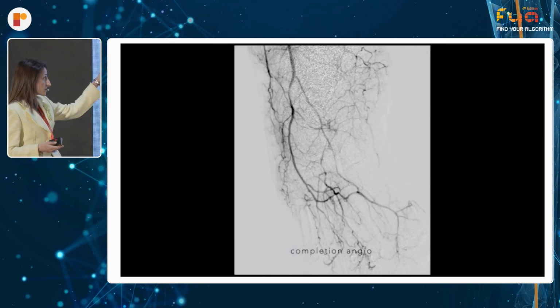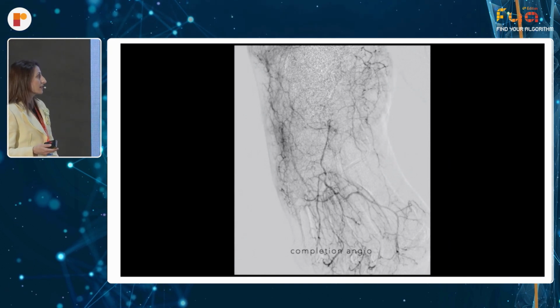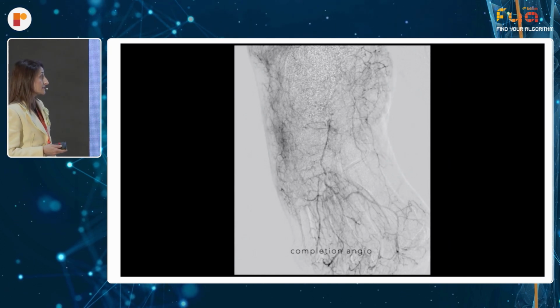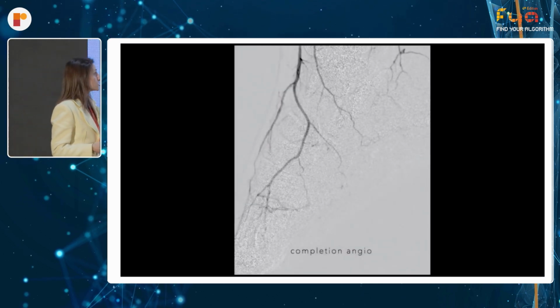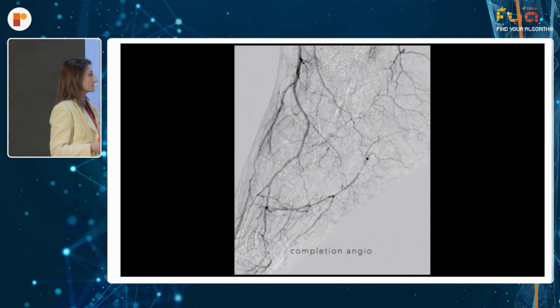As you see, very nice blush at the level of the wound in this AP view, and also in the lateral view, as you can see.